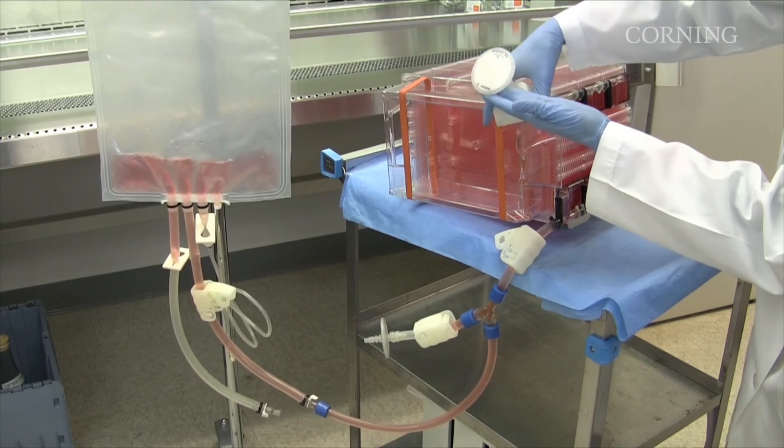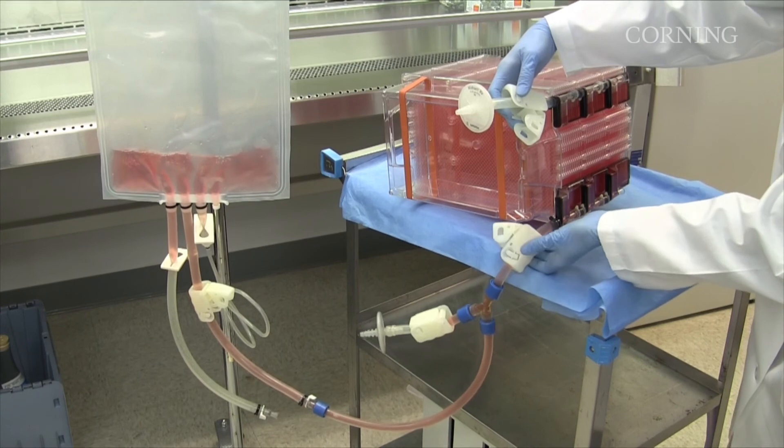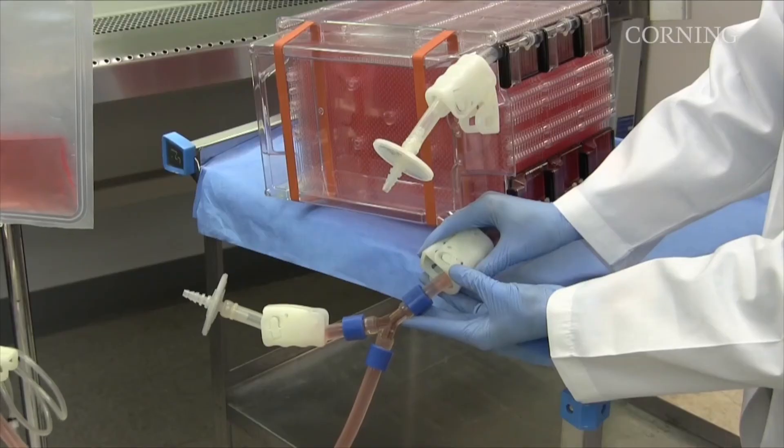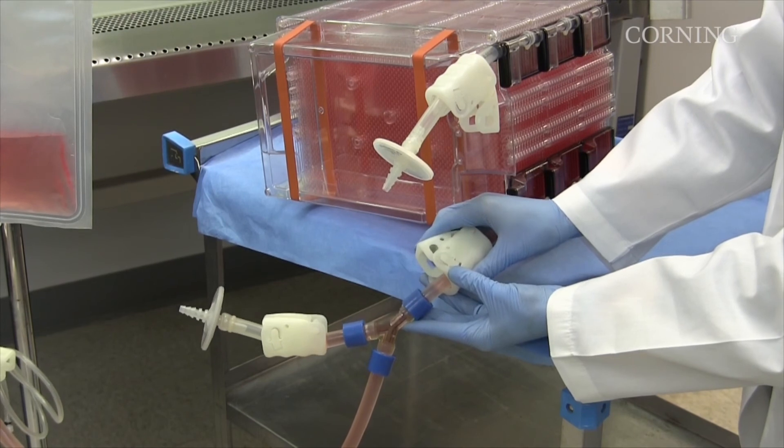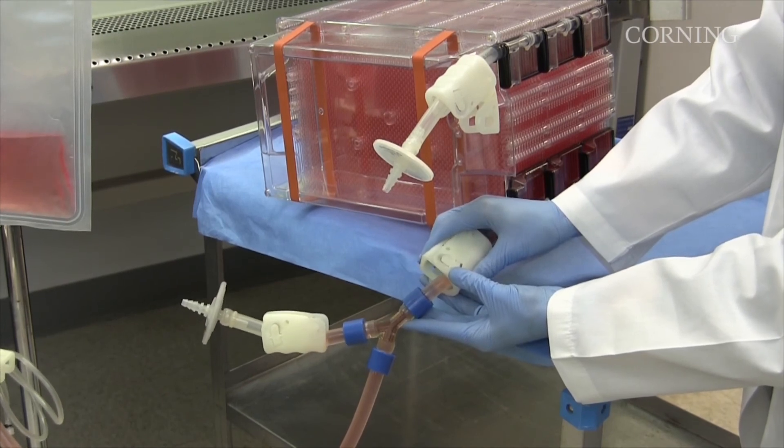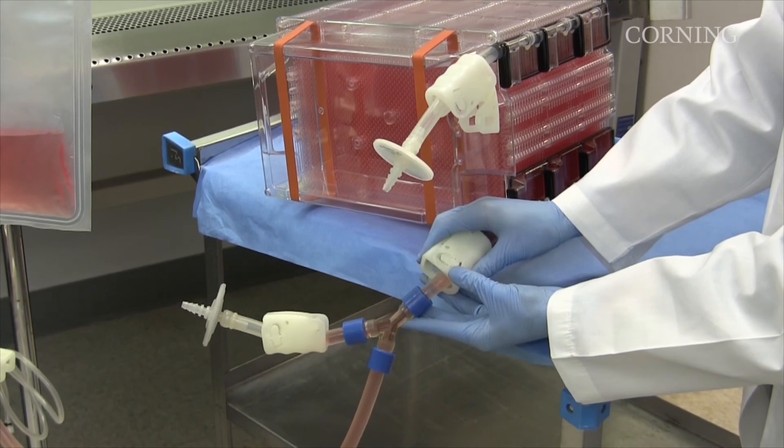Open the clamps on the collection container and the liquid handling tubing of the HyperStack vessel to initiate drainage. After liquid begins to drain, open the vent tubing clamp to allow air into the HyperStack vessel to continue the liquid flow. As with filling, do not allow the liquid to flow too quickly. Use the liquid handling clamp as a handbrake to control the flow or vary the height of the collection vessel.